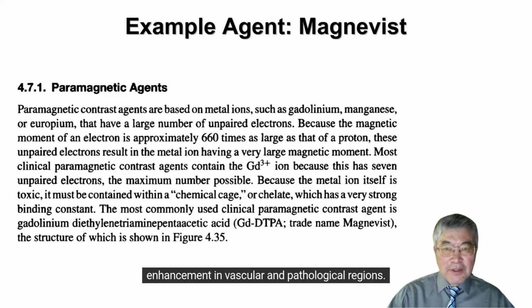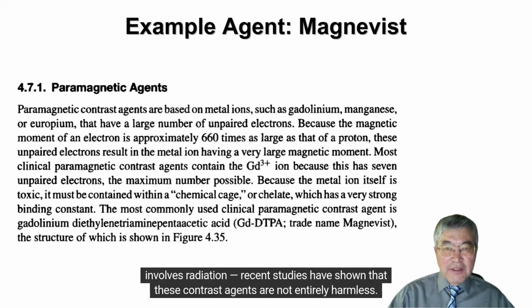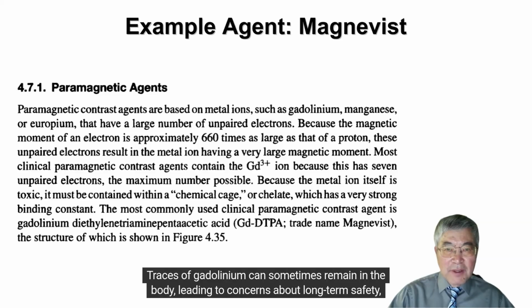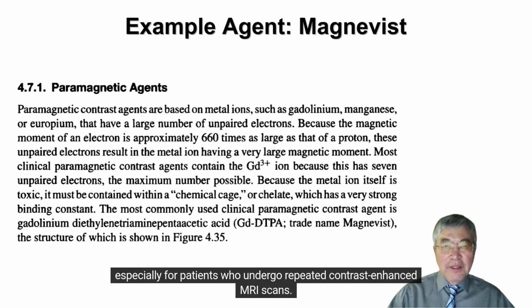However, although MRI itself is considered a green and non-ionizing imaging technique, unlike CT, which involves radiation, recent studies have shown that these contrast agents are not entirely harmless. Traces of gadolinium can sometimes remain in the body, leading to concerns about long-term safety, especially for patients who undergo repeated contrast-enhanced MRI scans.